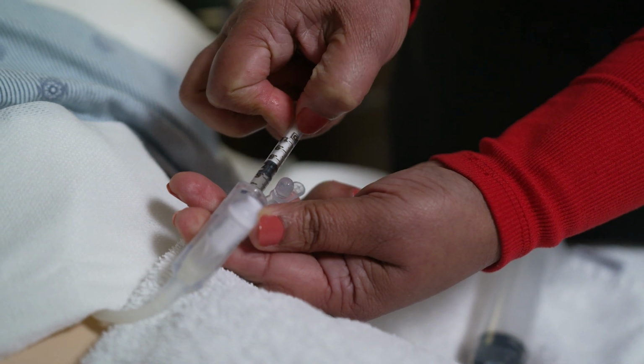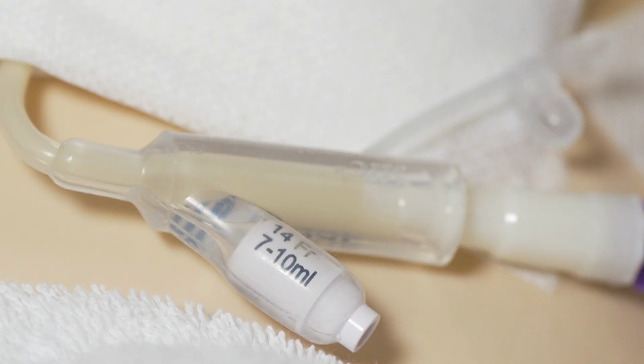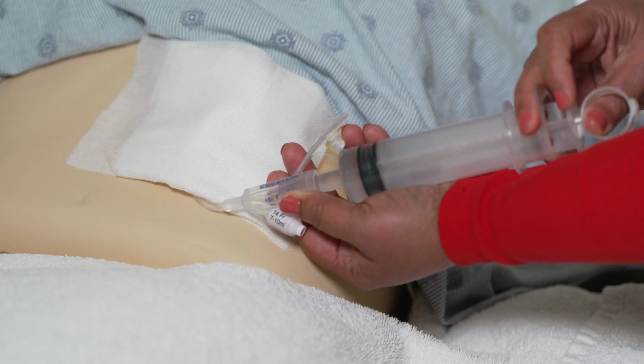Afterward, gently pull back the syringe plunger and try to loosen any formula. Repeat this process several times or until nothing comes out. Flush the J-tube with 60 milliliters of water. If you are unable to unclog the J-tube, contact your care team.